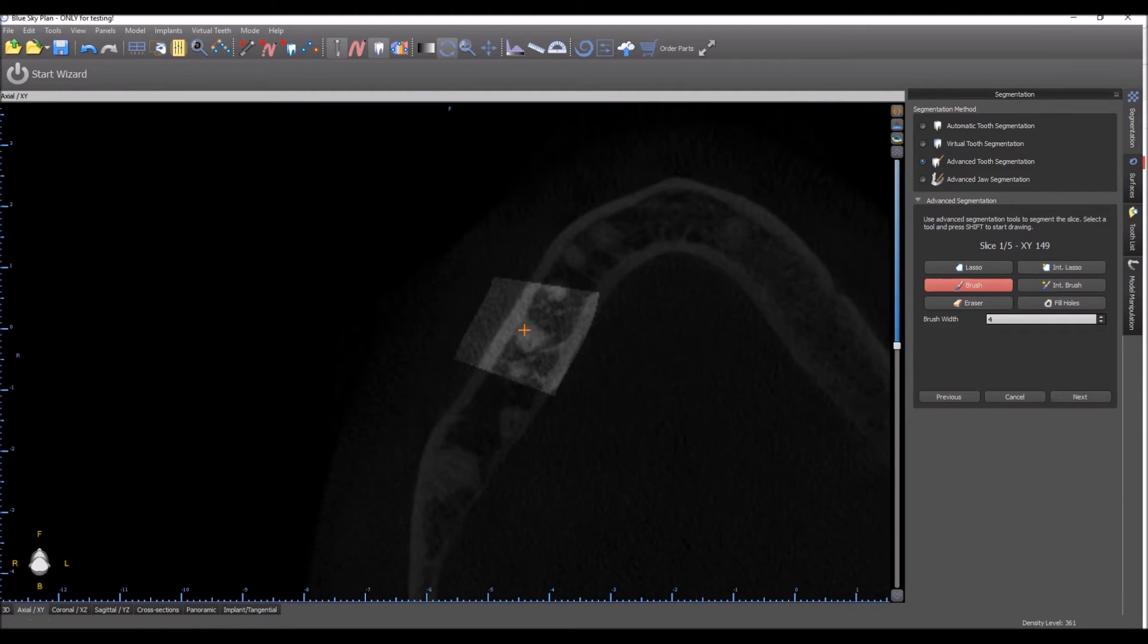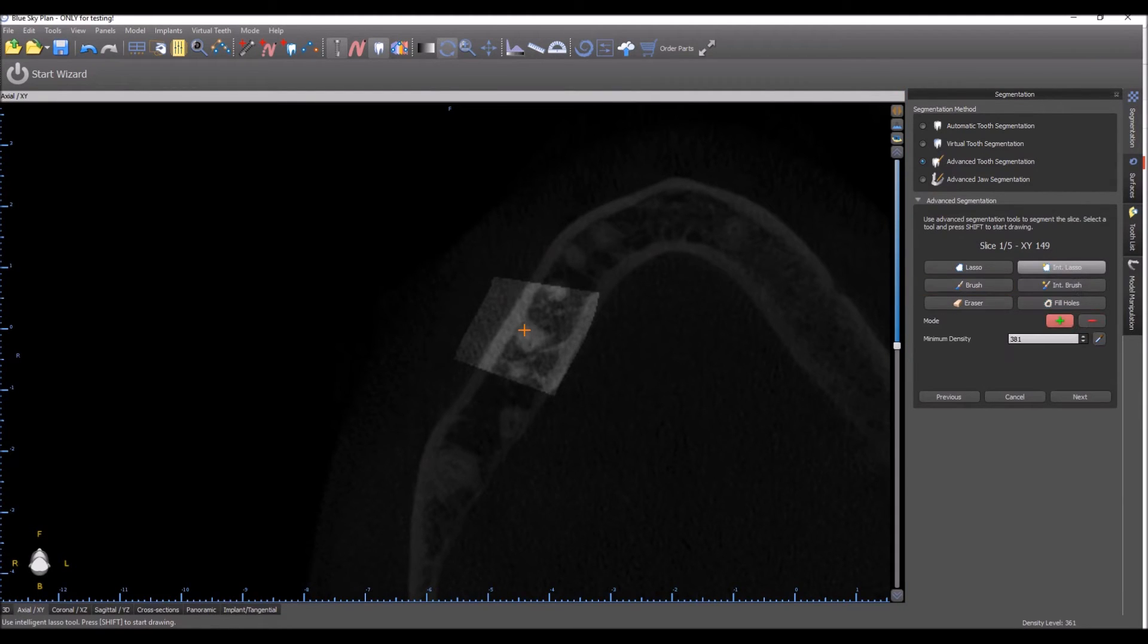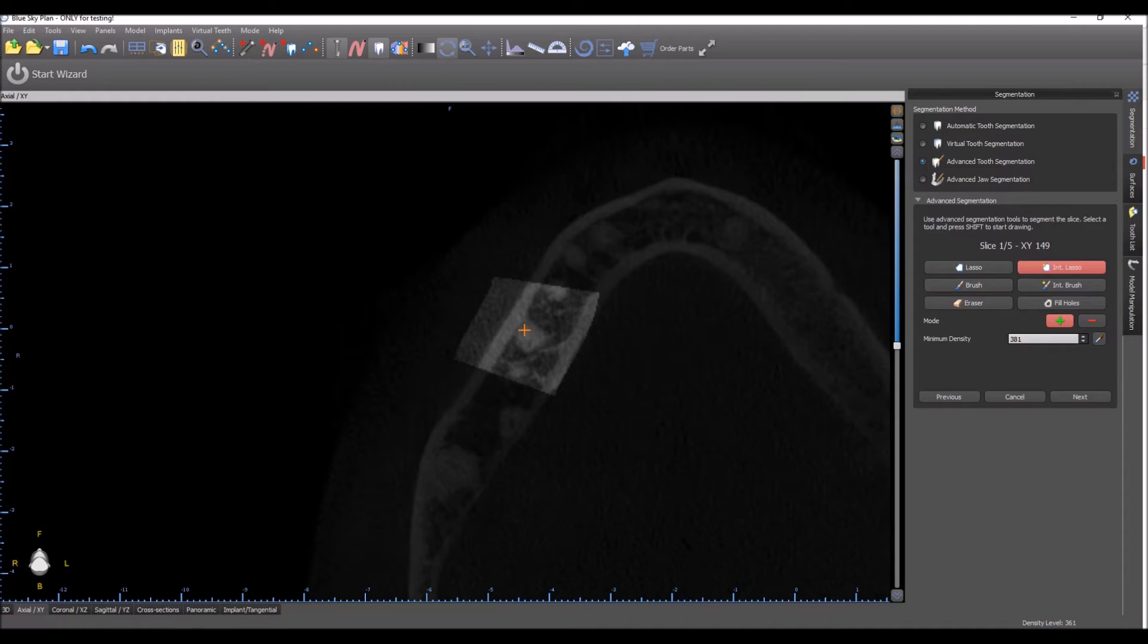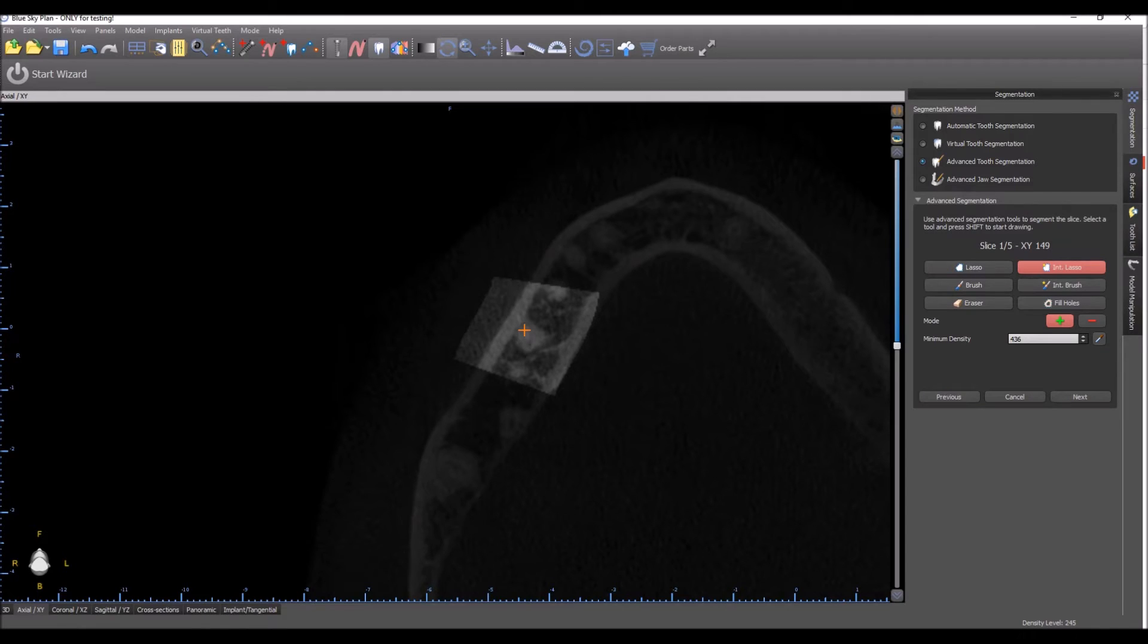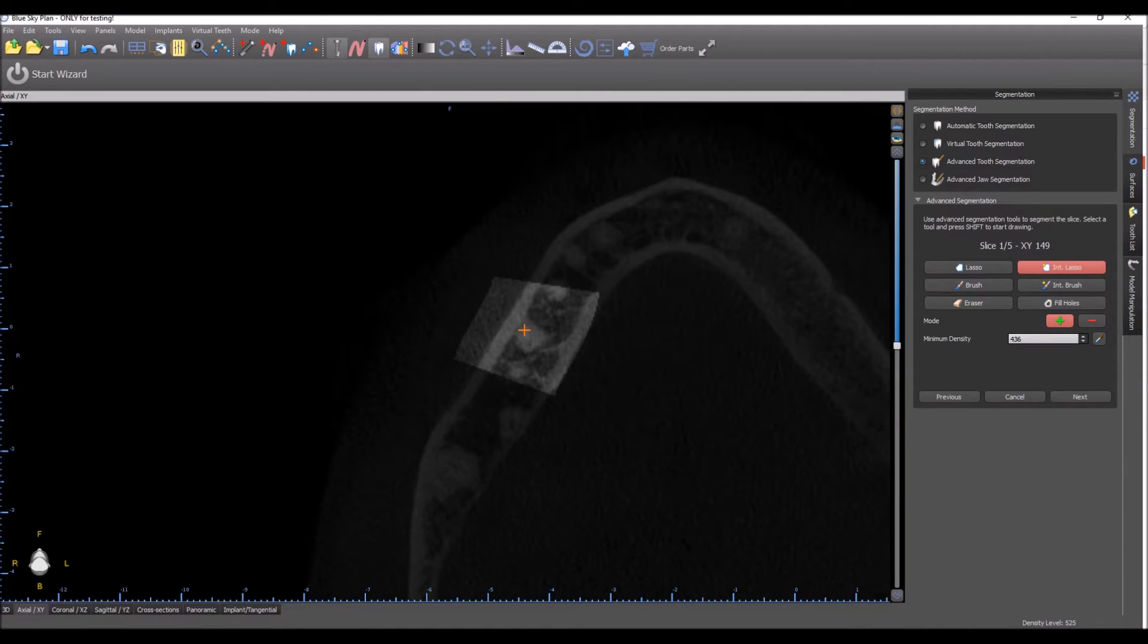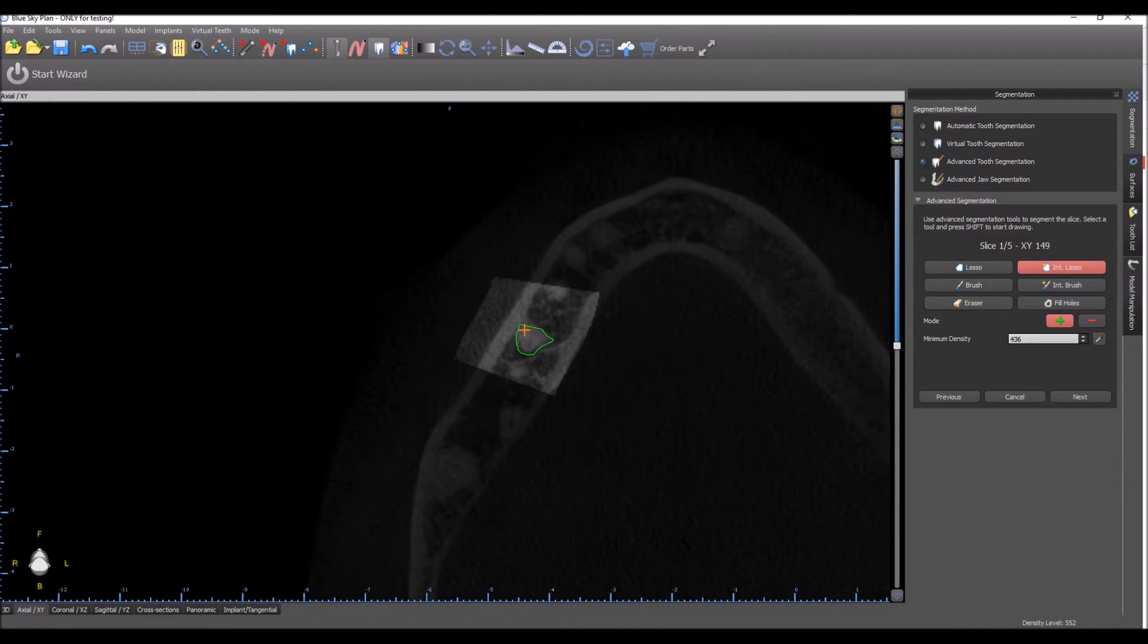The tools that we have at our disposal are on the screen. Generally, I like using Intelligent Lasso. The reason it's intelligent is because you're able to select the minimum density. You can use the dropper, click on screen, and the minimum density gets updated. So nothing below this density is going to be selected automatically. Whenever you use a tool, you hold down the Shift key. The orange cross on the screen shows us the vicinity of the tooth that we chose.